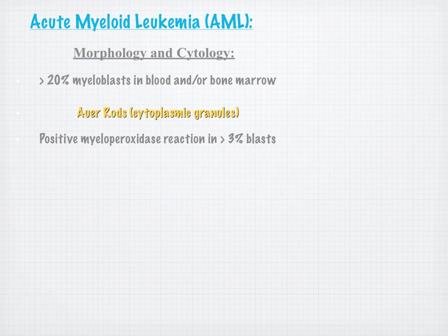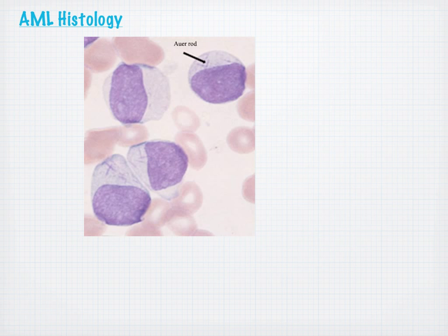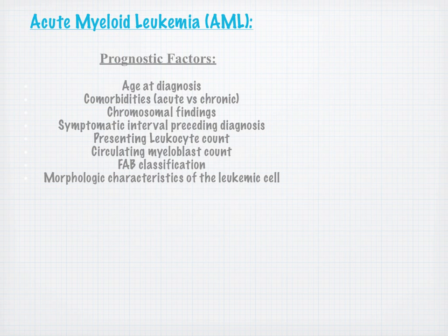And positive myeloperoxidase reaction, we haven't talked about that yet, but I do want you to think about the Auer rods, the old dead white guy named Auer, who named this finding after himself, and I'll show you a picture here in a little bit. There's some blasts, and here's a little bit. There's the Auer rod.